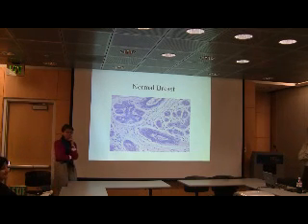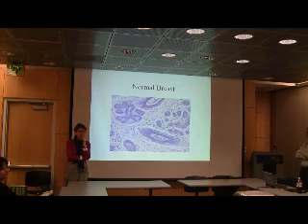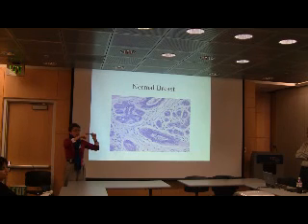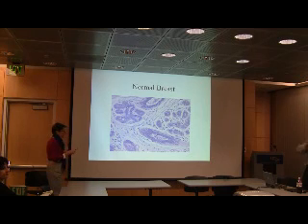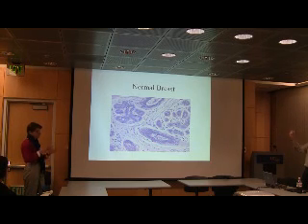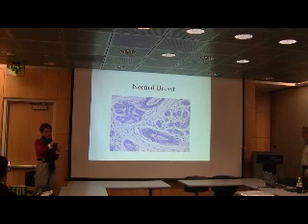I mean, I understand. We understand all the cartoons, like this is what a normal looks like, and then DCIS and all this. But how do you tell? Because it's cut like this. Right. But how do you tell if it's cut a certain way, or if it looks like a pathology? It looks like a mess, but in fact, Britt has trained her eyes over 20 years of looking at this. I know that this is only one layer. She can see it's tangentially cut, so it piles up a little bit, but it's within normal limits. So I know this is normal.